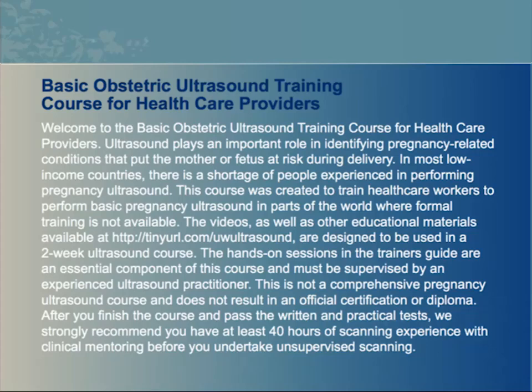Welcome to the Basic Obstetric Ultrasound Training Course for Healthcare Providers. Ultrasound plays an important role in identifying pregnancy-related conditions that put the mother or fetus at risk during delivery. In most low-income countries, there is a shortage of people experienced in performing pregnancy ultrasound. This course was created to train healthcare workers to perform basic pregnancy ultrasound in parts of the world where formal training is not available.